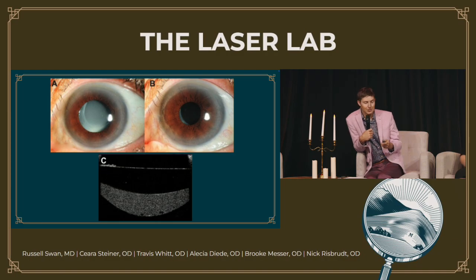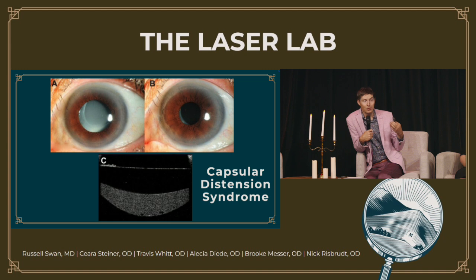It's capsular distension syndrome, and opacification or murky fluid accumulation behind the capsule can also have some retained viscoelastic in it, and is the absolute most fun YAG in the whole world to do. Because you do one YAG and then you just see this milky fluid go right back into the vitreous, which is so fun. And you're like their hero, although they're kind of mad because they got real blurry, but they really can see instantaneously a lot better.